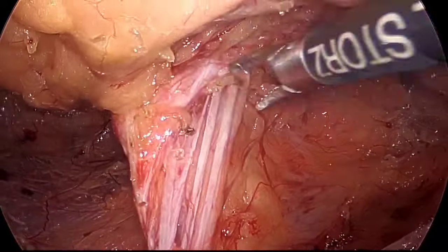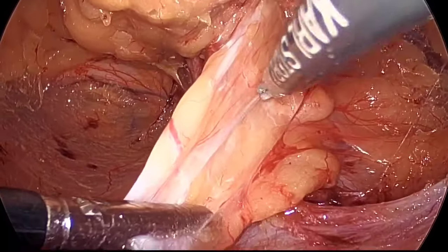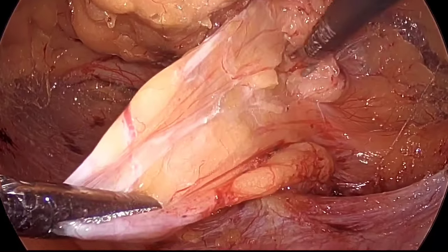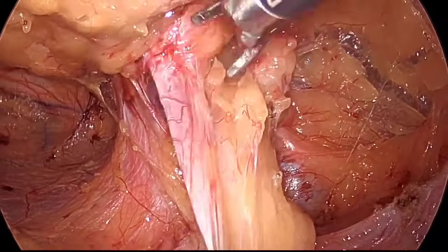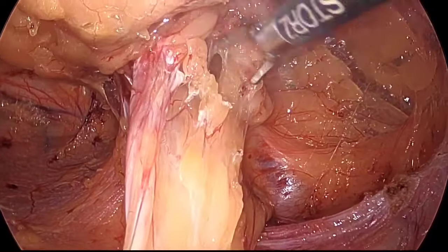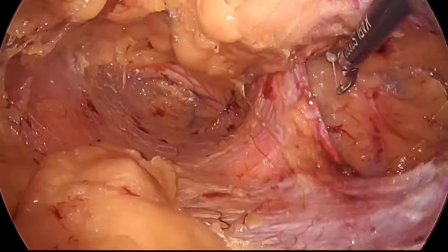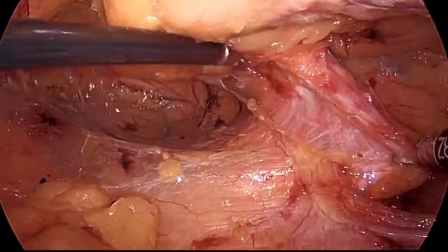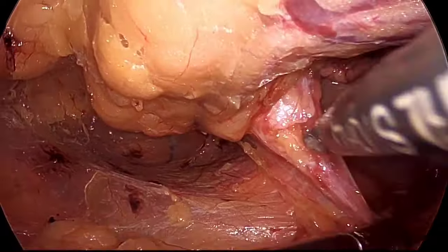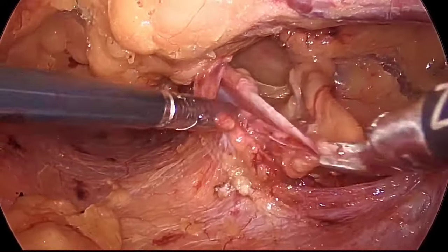So in this kind of recurrent groin hernias, what we need to plan is to have enough space all around the defect, because there will be adhesions of the sac with the incision line, and at a certain point of time after dissection all around the sac, we need to divide the sac, because otherwise we won't be able to bring down the whole sac from the scrotum, and it was not needed actually. So once I have created enough space towards the defect area, I will be dividing the sac.